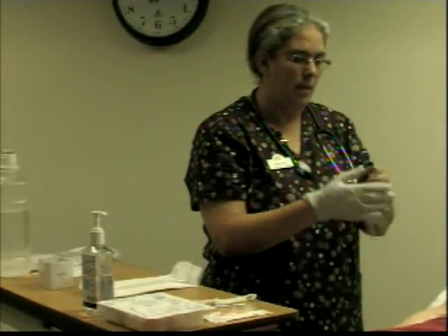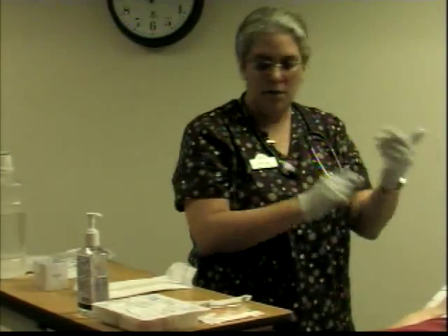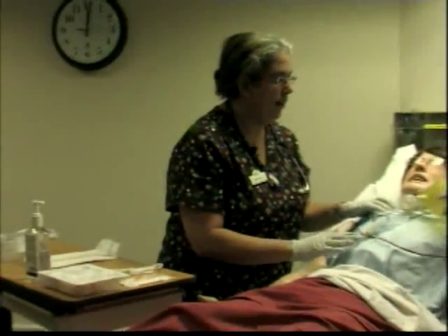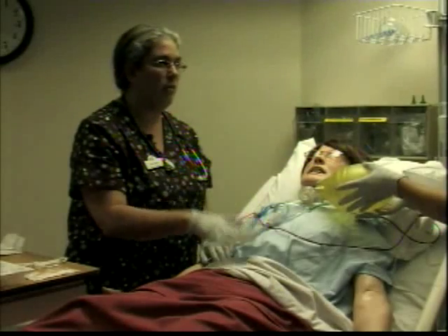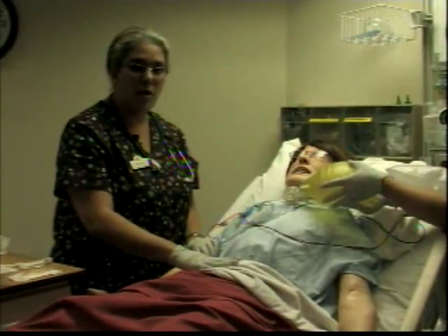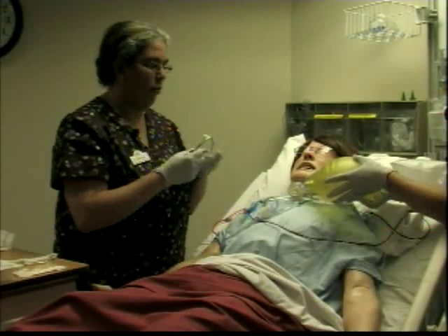I'm going to put my clean gloves on for a second, because I'm going to do a little assessment. Notice that I haven't opened any of these packets, so it's not exposed in there. I already had a baseline of heart rate, respiration, blood pressure, and pulse ox, as I mentioned before. And I listened to her lungs, and I'm going to do it one more time.